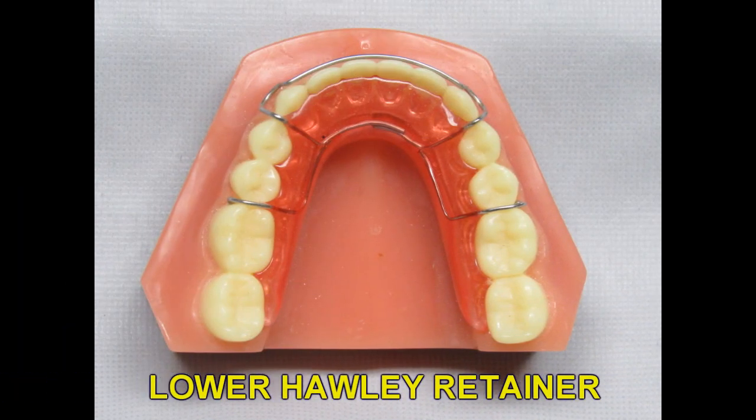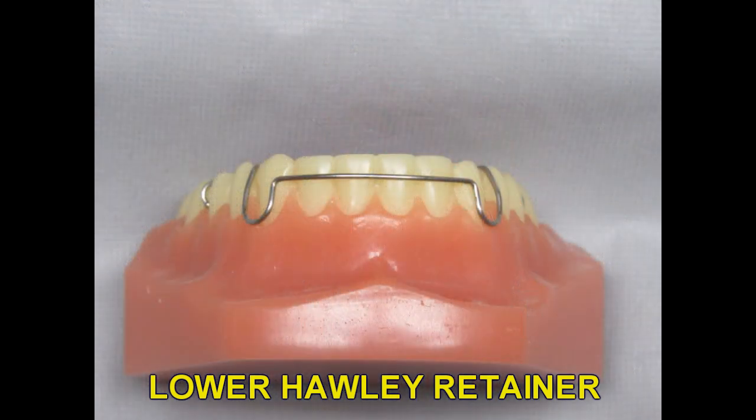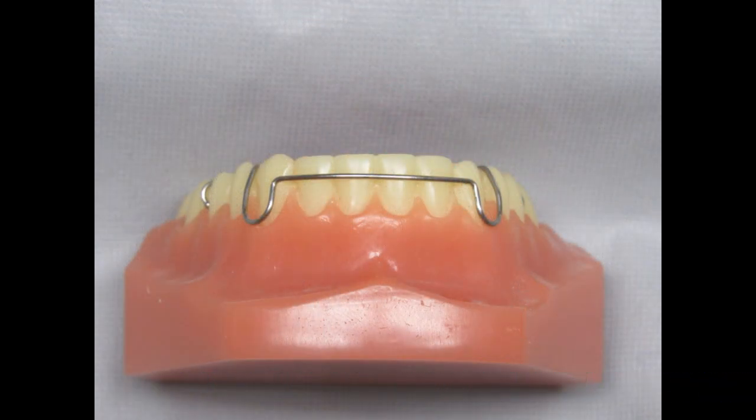This is the lower Holley retainer. It works and functions exactly like the upper Holley. It's held in place with ball clasps on each side and has an anterior labial wire to help maintain the anterior teeth in their new position. You can also add finger springs to it if you'd like to align the teeth during the retention phase.